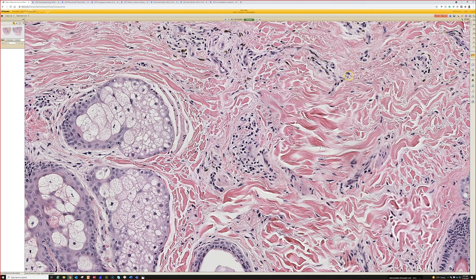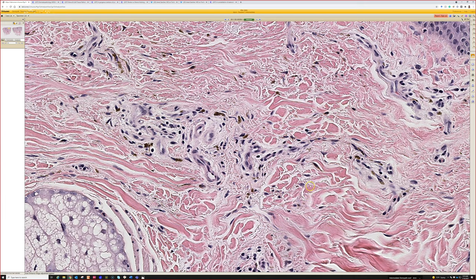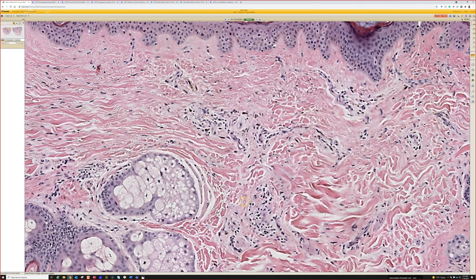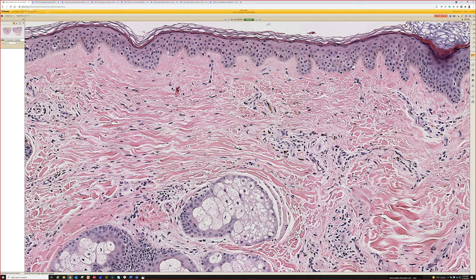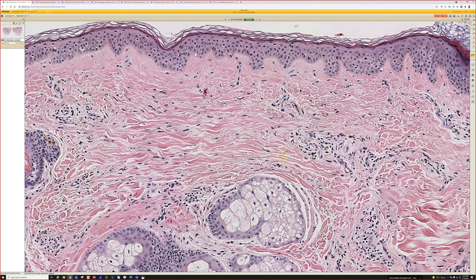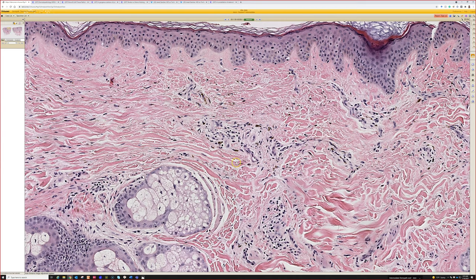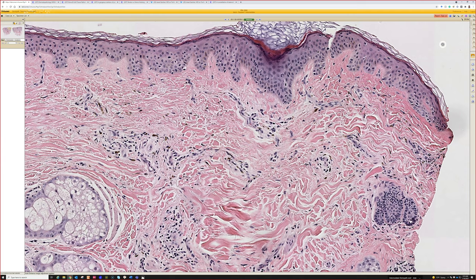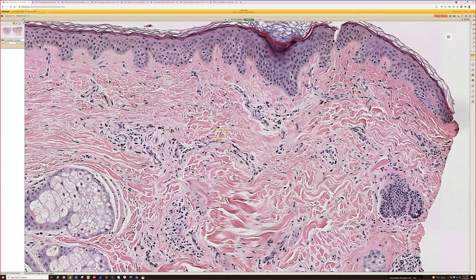Like a nevus of Ota on the face — dermal melanocytosis. Dermal melanocytosis is a nice category to put this in. It encompasses nevus of Ota on the face, nevus of Ito which is usually the shoulder region, and also the entity formerly known as Mongolian spot on the lower back of babies in patients of certain ancestry with usually a darker skin type. All of those show similar findings: scattered pigmented spindled melanocytes scattered in the dermis.